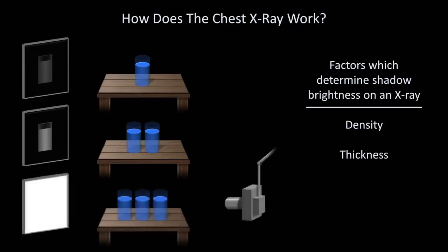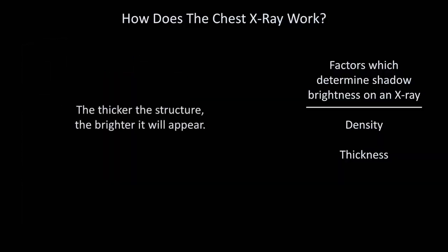Finally, if we shoot X-rays through 3 glasses of water, the image of the glass will be brighter still. In summary, the thicker the structure, the brighter it will appear on the X-ray film.